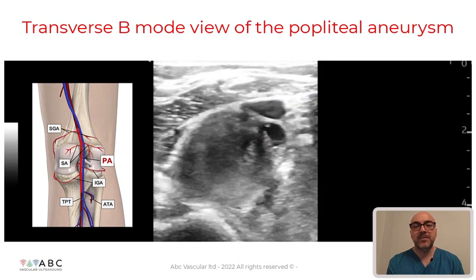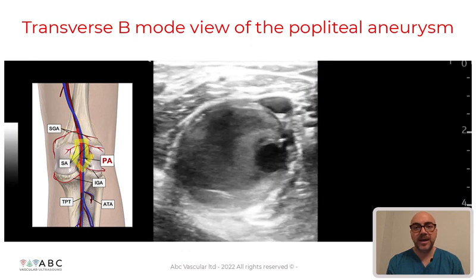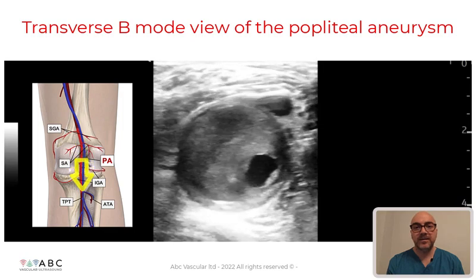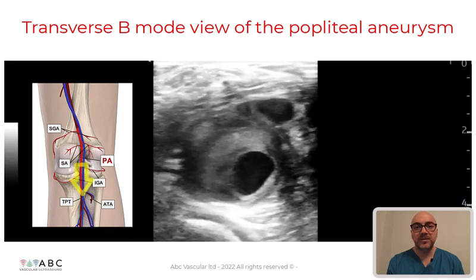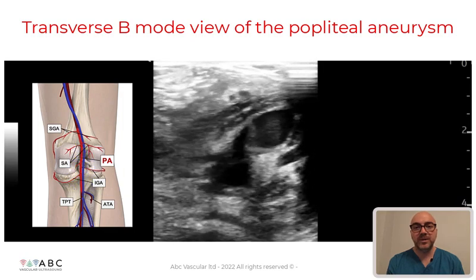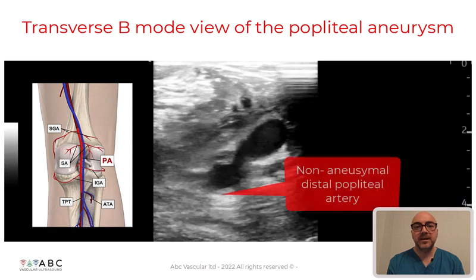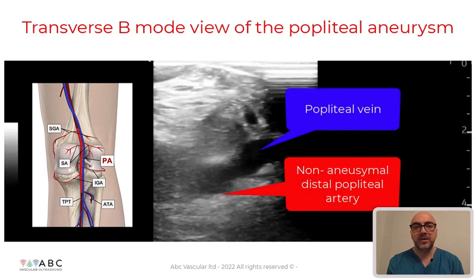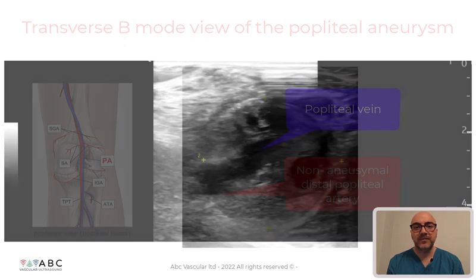By sliding the transducer back down we can identify again the aneurysm, the thrombus, the patent residual lumen, and the distal segment of the non-aneurysmal popliteal artery and vein.